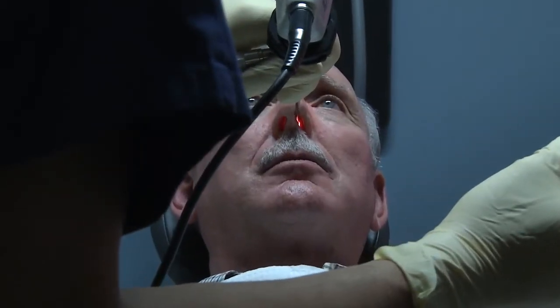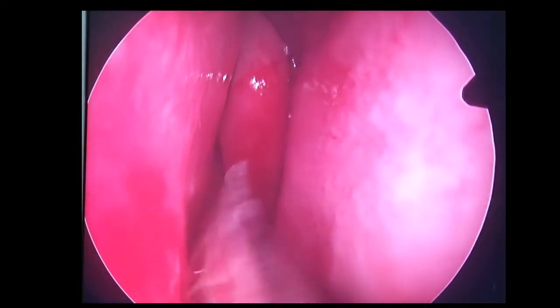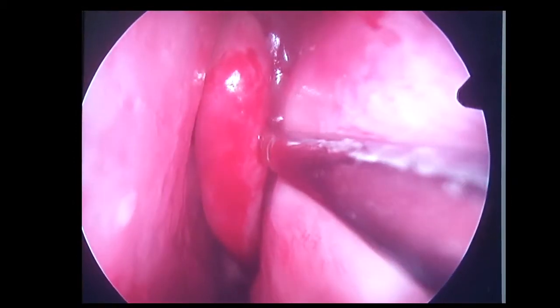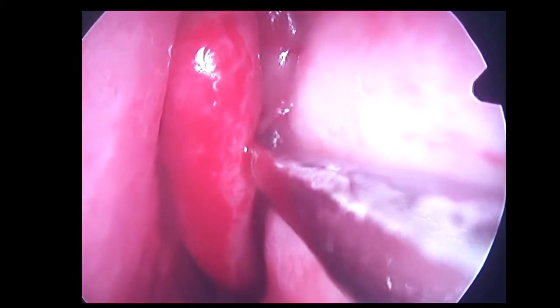So just like we did before, you're going to feel that camera slide into there. We're looking at the inside of the nose, and we have a tissue here on the lateral side of the nose that's going to help block some of the openings that go into the sinus cavities. You're going to feel a little bit of pressure as I move that tissue over — you might even hear a little noise, a little crack, or a little pop.